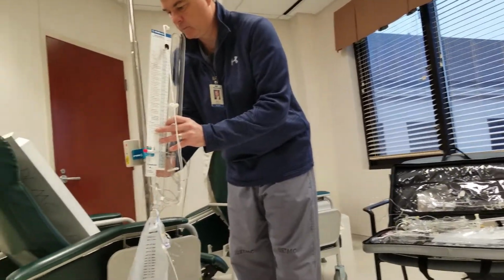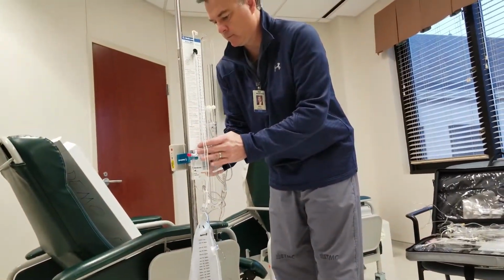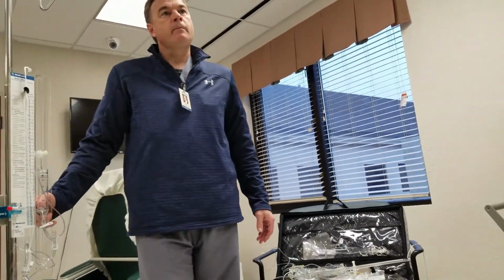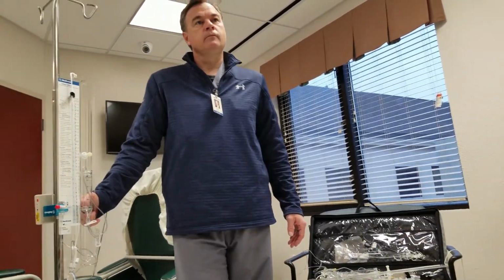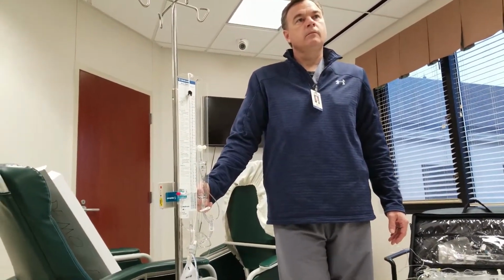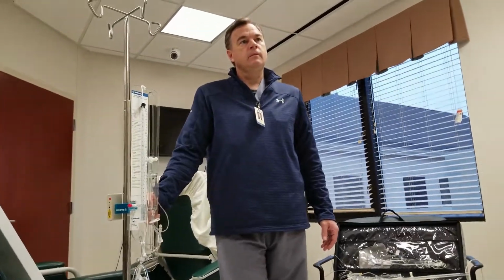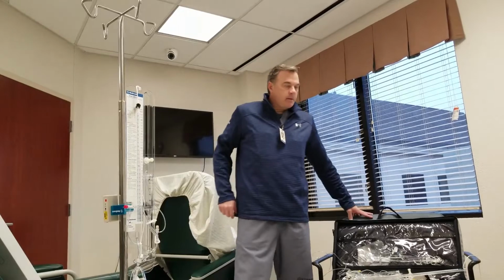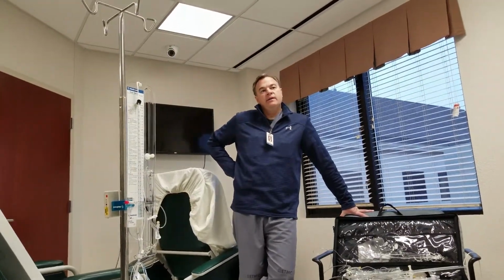We're still working on it. I will also say that in the policy, it does state that when you walk away from the lumbar drain, it is to be closed. Also, in your charting, it will ask you, did you close off the stopcocks and the valves before you walked away? This is one of the first drains, and this is why we're doing this in-service. Then Kara and I, probably in another couple weeks, will be doing some more in-depth education.